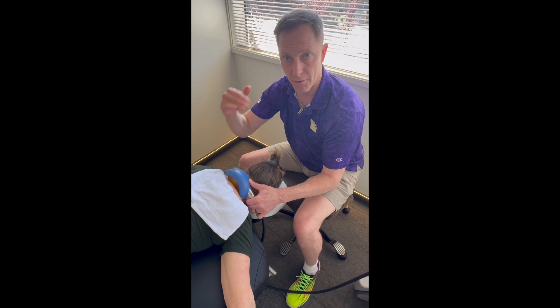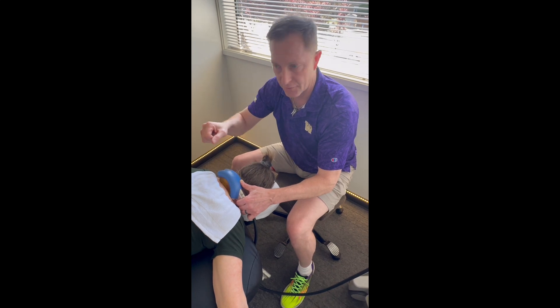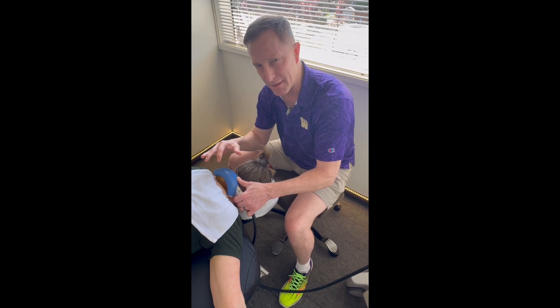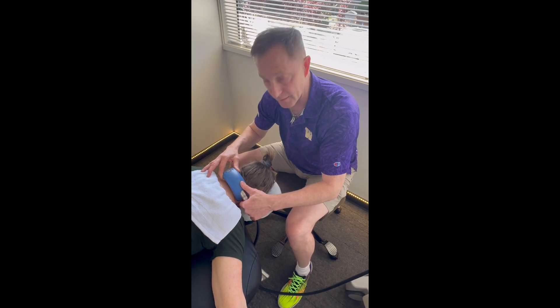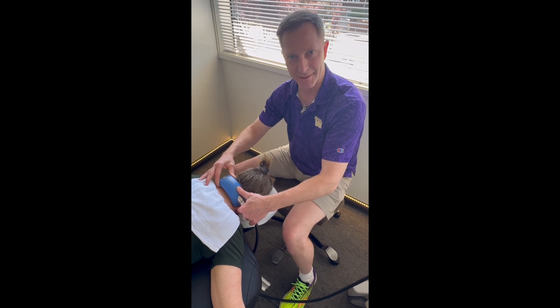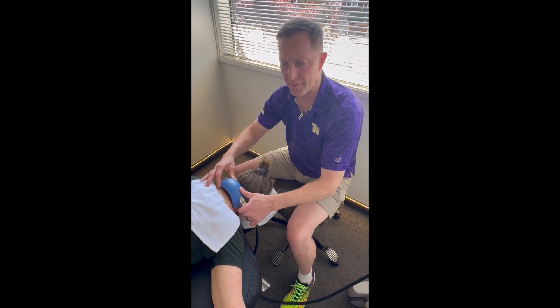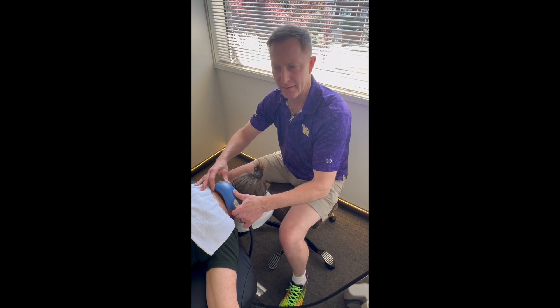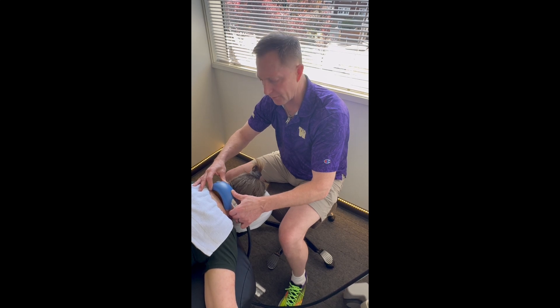We know we have our therapeutic level of intensity and frequency. You can see I'm just sitting there — this isn't a rub-rub-rub like a traditional ultrasound. This is more of a set-it approach with some exploration. I'm coming up the neck now. She really likes that — she says it's like the best massage ever. I'll give you an hour to stop doing that.